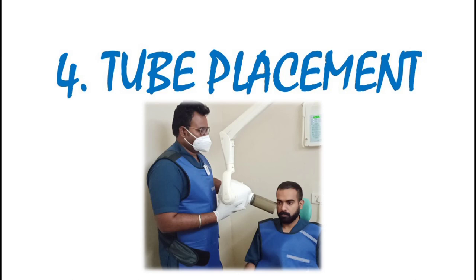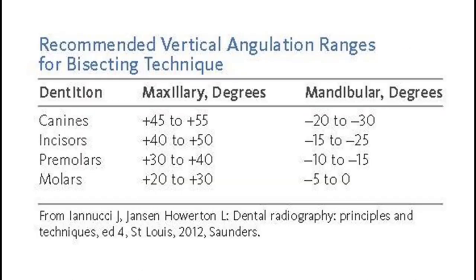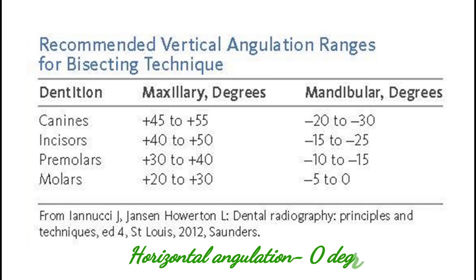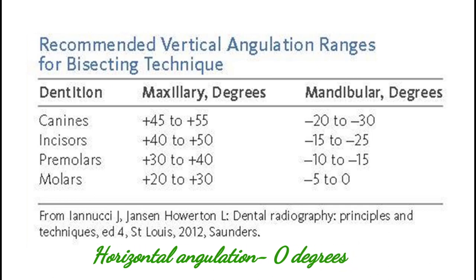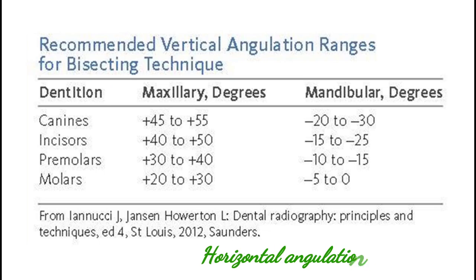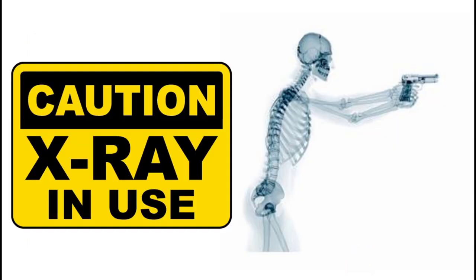The next step is tube placement according to the recommended vertical angulation values. Here we are using the bisecting angle technique, as the paralleling technique can be used only with the film holder. So now we are ready to shoot the x-ray.